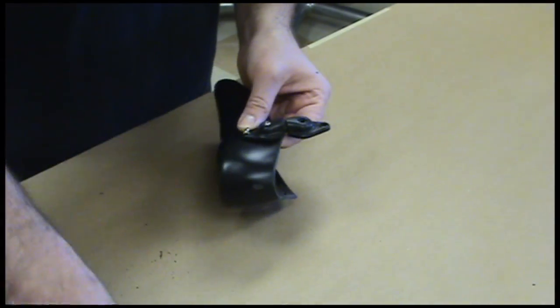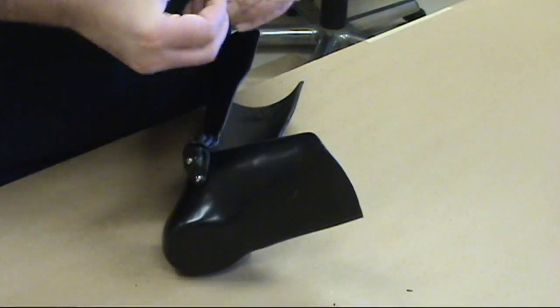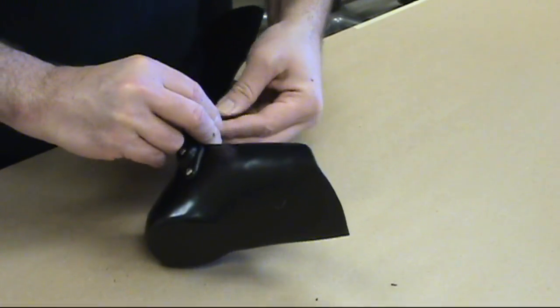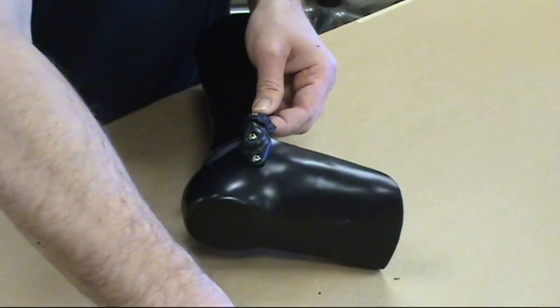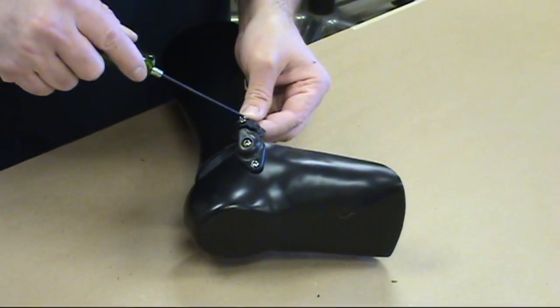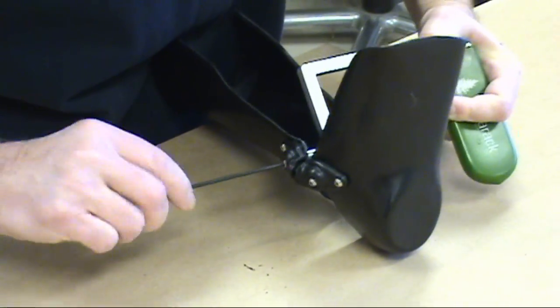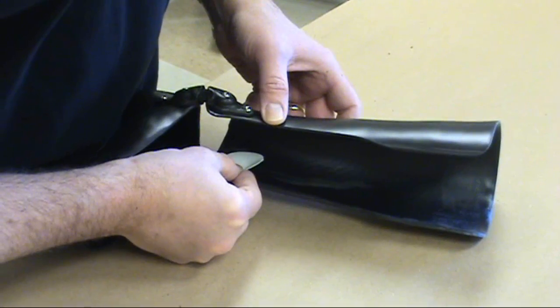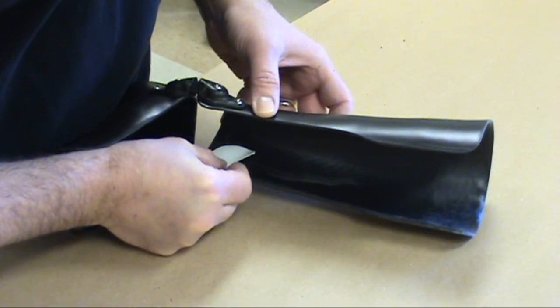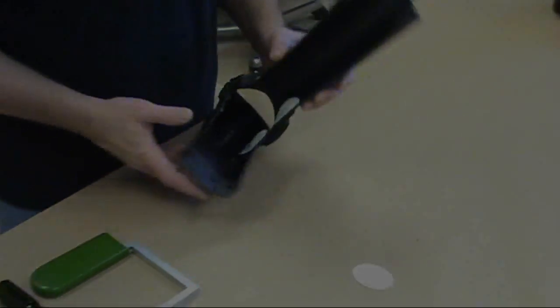Installing the Tamarack Flexure Joint Caps is easy using the provided screws and flange nuts. Ensure that the directional arrows shown on the front of the assemblies face the opening of the device. A hex driver and Tamarack Spanner Wrench make quick work of installing the attachment hardware. Cover the flange nuts with shearband oval patches, provided with each package, to ensure the client's skin is protected from any rough edges.